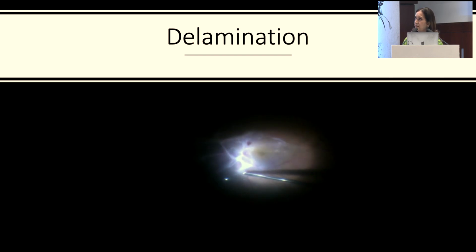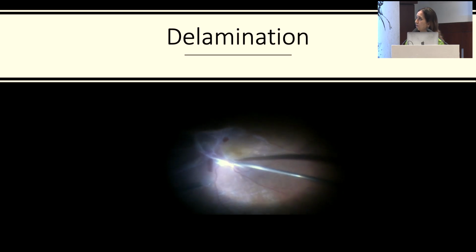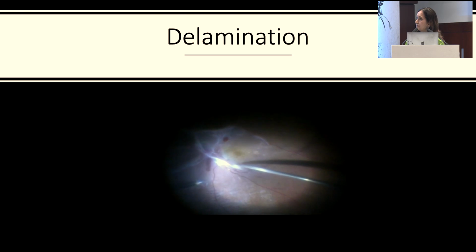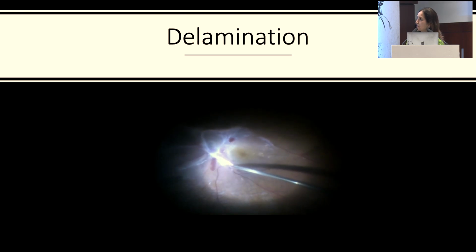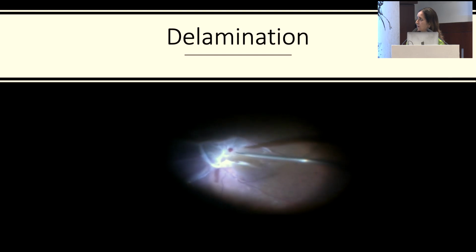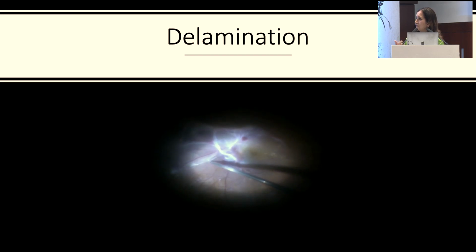Once you are into the right plane, you can see that the fibrovascular proliferation actually starts rolling into your cutter, and then I am a very ardent fan of the curved scissors. With that curved scissors I use it as a forceps, as a pick, as everything, and once you keep on lifting it, you identify those pegs and then you cut. So I don't need to use any other instrument. Once in, I finish most of the surgery with the scissors and come out.